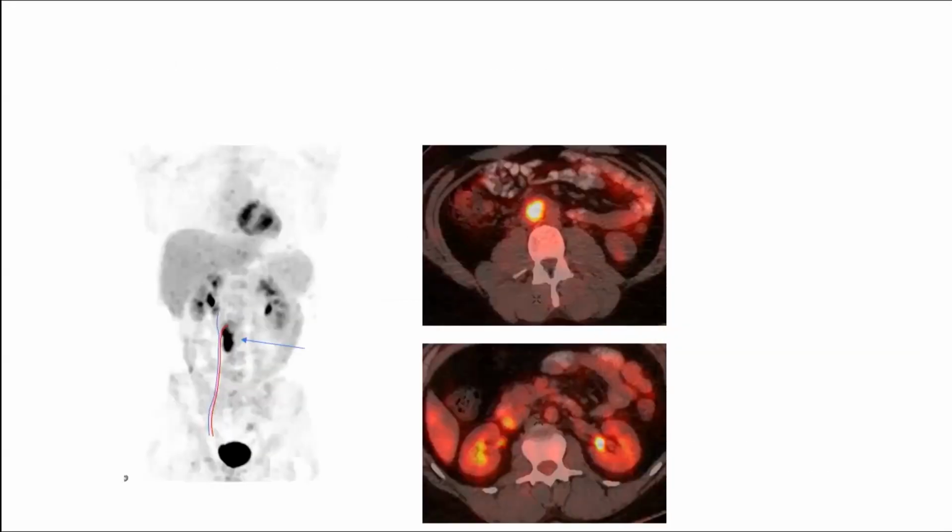So when we talk about lymph nodes, we always imagine a picture of artery and vein surrounded by yellow lymphatics and lymph nodes here and there. However, it's artery and vein. In this case, for example, for ovarian vessels, artery and vein reach different places.